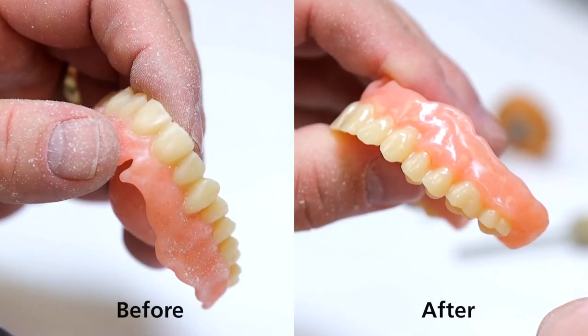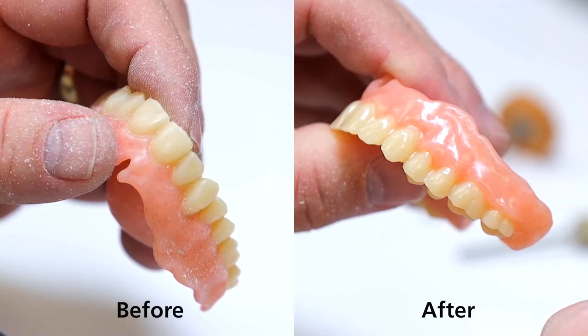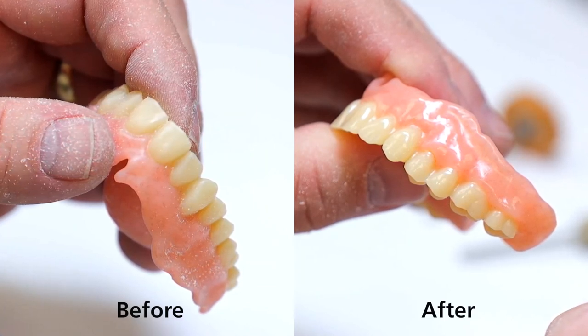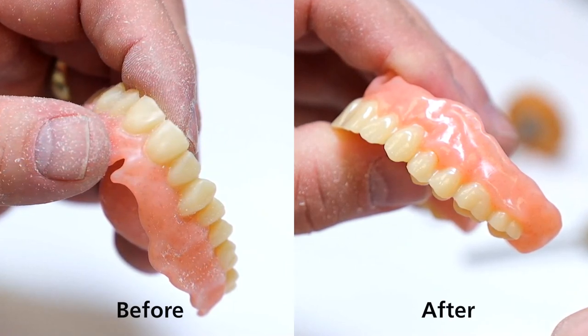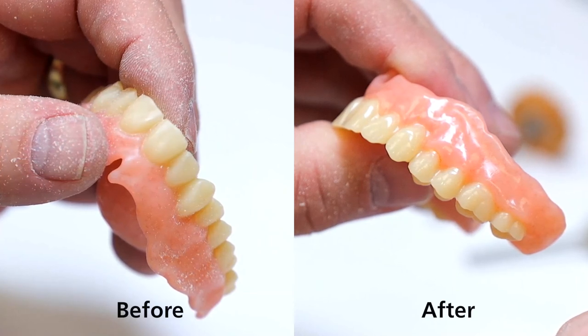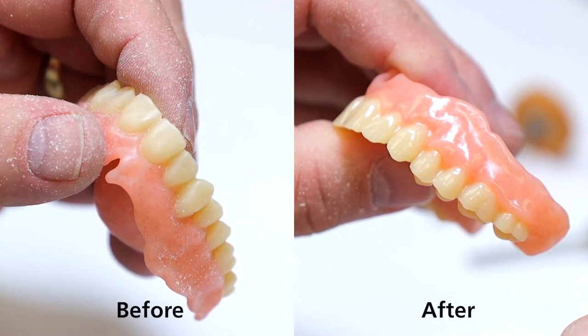So about 15 minutes of polishing, and I've done half of it, from taking it out of the disc, contouring it, and of course I'm explaining as I go. So on average, 10 to 15 minutes to complete an arch in polishing, depending on the detail you want to apply. So you can see, that's it. I'm going to take it, clean it, after I do the side, of course, put it in the denture box, and it's ready to be delivered to the patient.